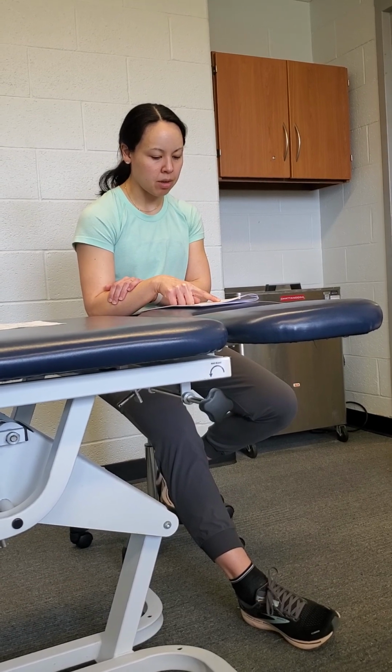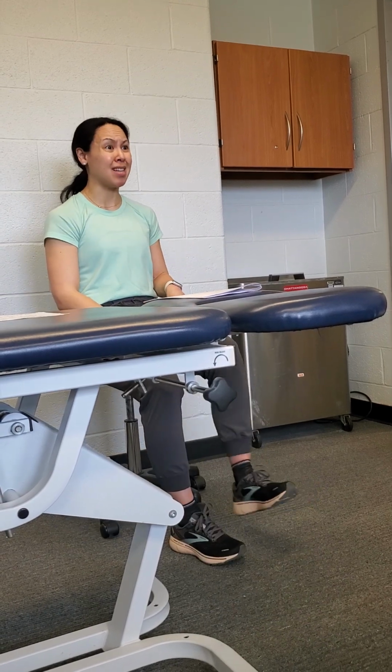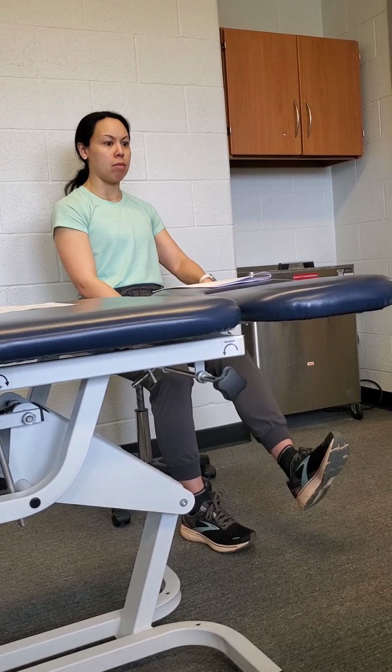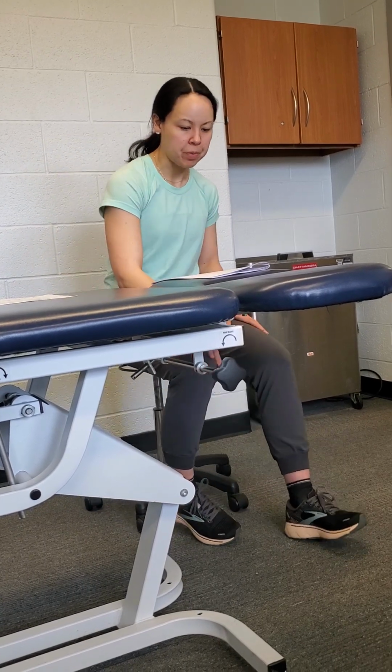So you would probably use the Pre-Core, you think, and set them up, and you could do your isometrics at 90 and 60. The stim is on, right? And then they're doing their isometrics when the machine is on, and the BFR is just on. Okay. Yeah. Yep. Exactly.